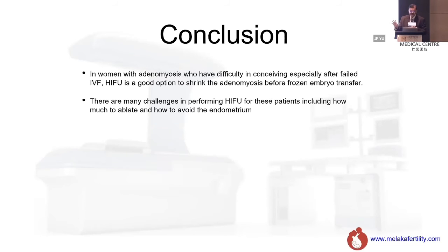Okay. There are many challenges in performing HIFU for these patients, including how much to ablate, how to avoid the endometrium. These are big challenges. And I'm still learning every day what is the correct dosage of energy I'm going to give at which point. It's a learning curve.